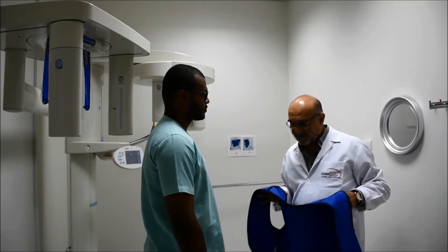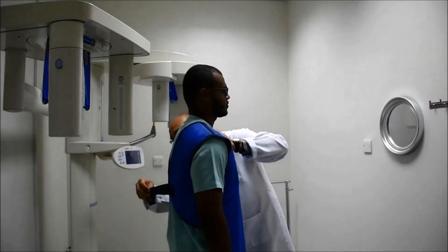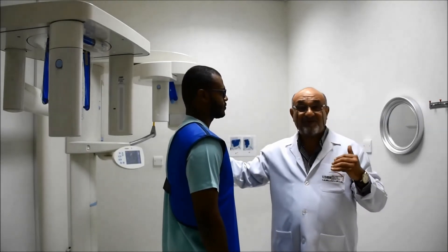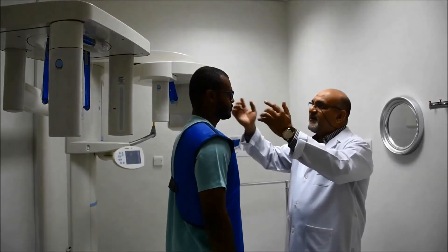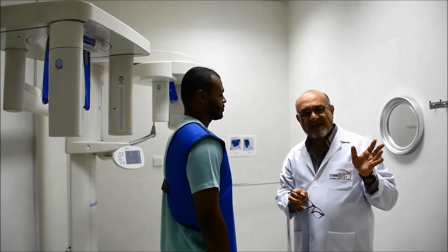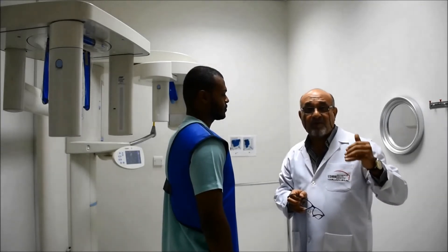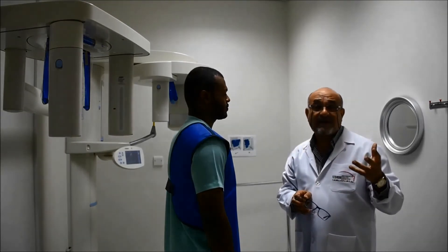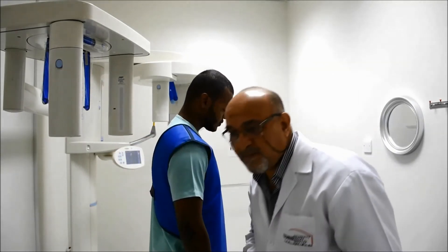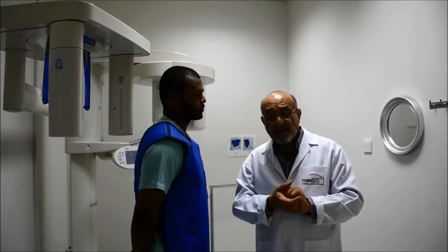Make sure the lead apron is placed properly and inform the patient that it is heavy, especially for those who have never worn one before. Ask the patient to remove eyeglasses and anything in the oral cavity: dentures (acrylic or chrome-cobalt), space maintainers, removable orthodontic appliances — anything removable should be taken out prior to exposure.